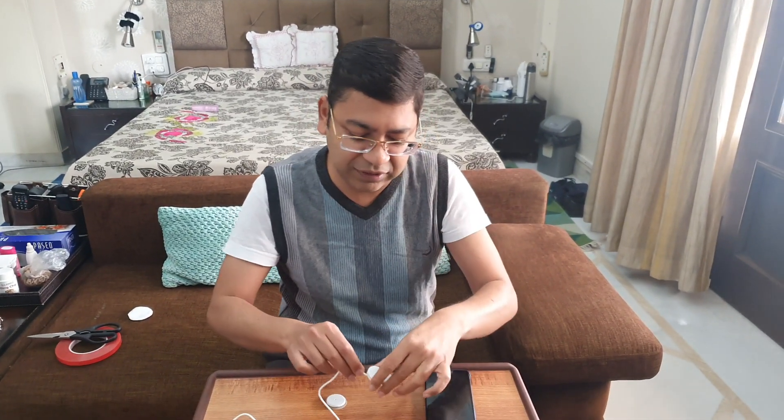Now this here is the Bubble. It's also called Bubble, and this is a product from Sweden. Let me just show you the box.